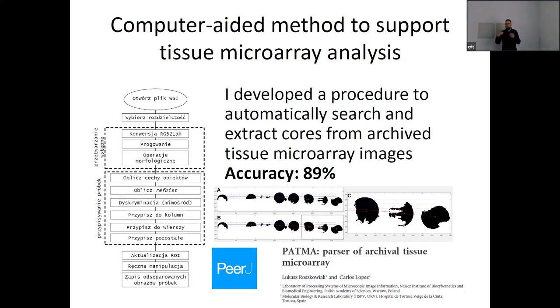So it was unnecessary to apply deep learning, because I would have to label them, to manually segment them, to manually pinpoint the location of each punch for, I don't know, 1, 2, 3, 4 images to establish the data set. And establishing this thresholding algorithm really took less time.